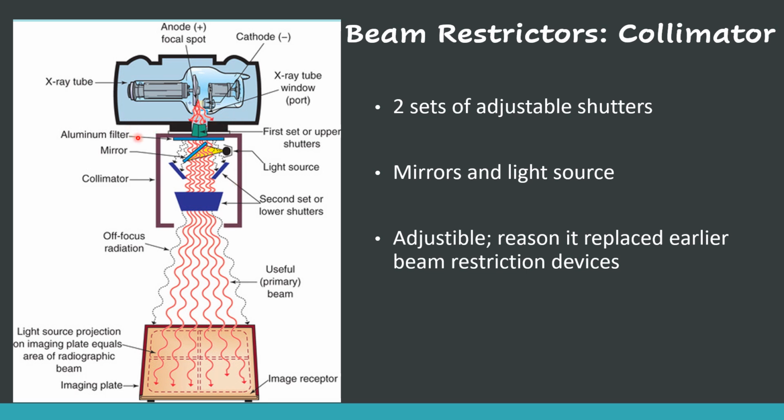What's important to remember is there are different types of filters. We have aluminum filters here, and usually lead shutters as well.